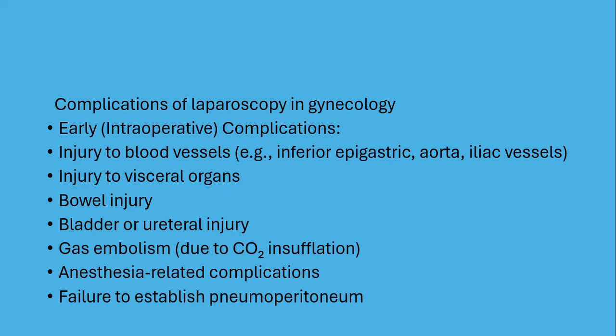Complications of laparoscopy in gynecology. Early, intraoperative, complications. Injury to blood vessels, for example inferior epigastric, aorta, iliac vessels. Injury to visceral organs. Bowel injury. Bladder or ureteral injury. Gas embolism, due to CO2 insufflation. Anesthesia-related complications. Failure to establish pneumoperitoneum.